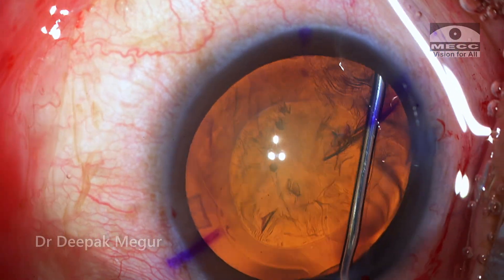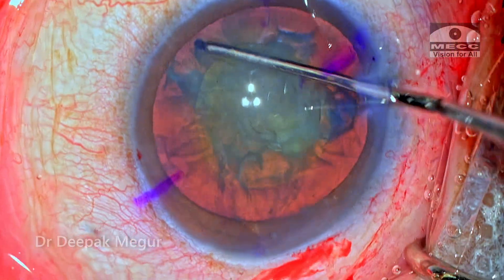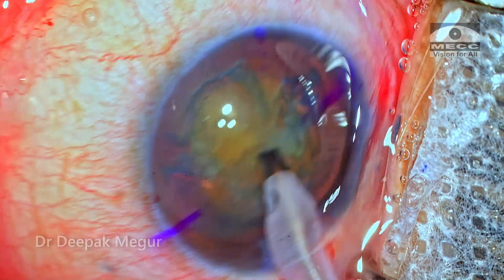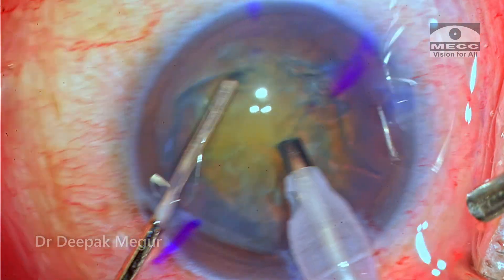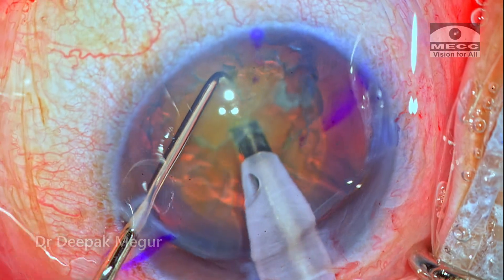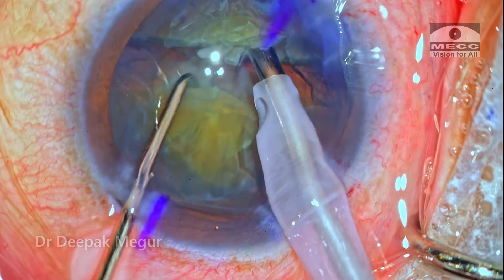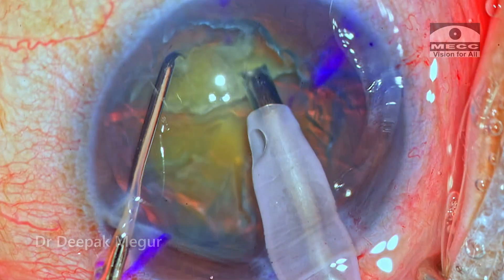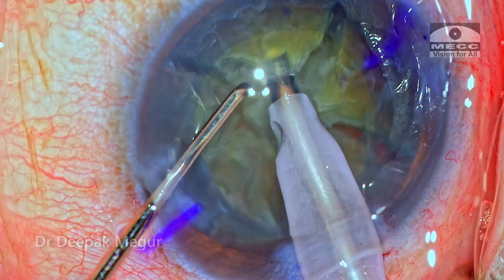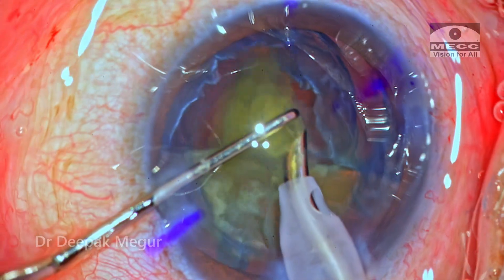The hydrodissection is created, and in these myopic eyes my strategy is usually to work with a slightly lower bottle height so that we don't have sudden deepening of the anterior chamber. Whenever this happens, the patient experiences pain due to a stretch on the ciliary body because of sudden deepening of the anterior chamber. So I prefer to work at a low bottle height. The nucleus management is quite standard — the nucleus is around plus 2 or plus 3 and direct vertical chop can be easily performed, and the fragments are then being emulsified.